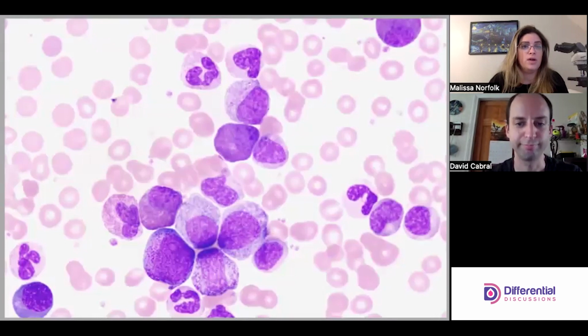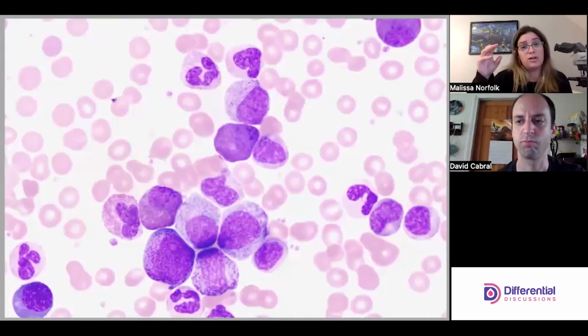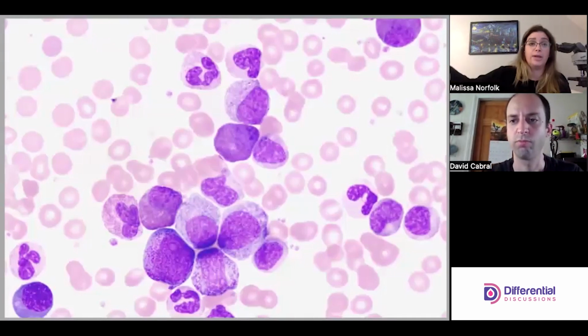They'll have increased leukocytosis, the increase of their white cells, but also a slight thrombocytosis, and that's just because of the nature of these genetic mutations that can impact multiple lineages. That's why we could see both lineages being increased, with, of course, the white cell lineage predominating.